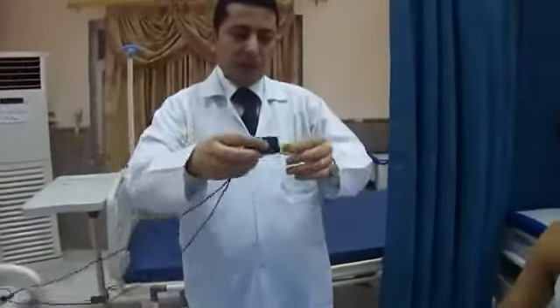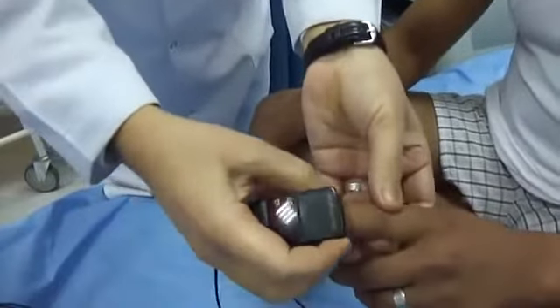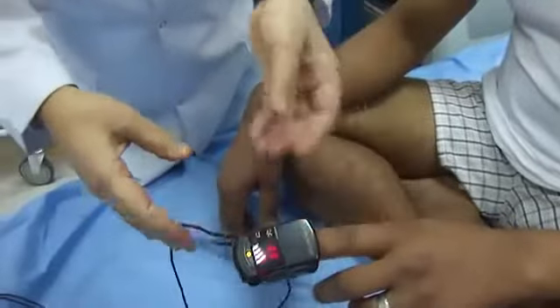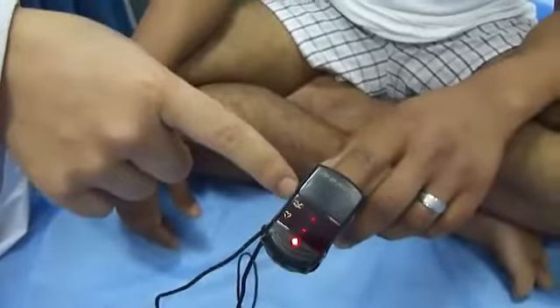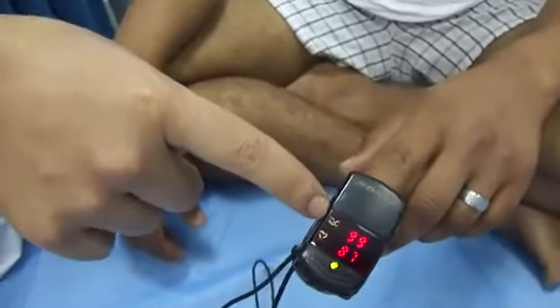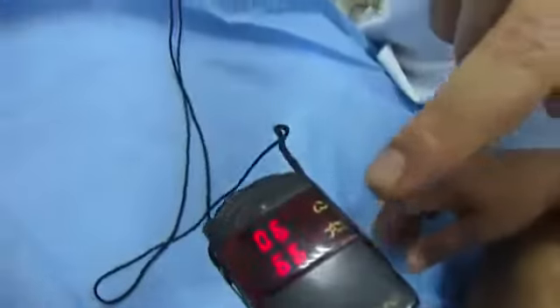Lastly, we have to check the pulse oximetry using a pulse oximeter. This is the pulse oximeter, and I'll check the patient's left index. First of all, you have to choose 2 or more areas, and we will see here the saturation of oxygen. The saturation of oxygen of our volunteer is 99.